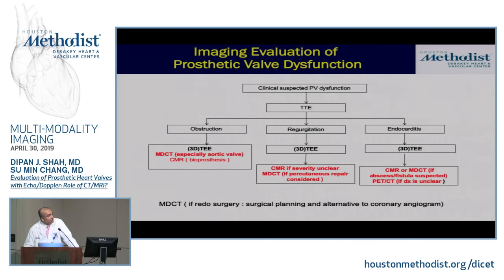And then obviously for endocarditis, really there's not a role for CMR or even CT in diagnosing endocarditis. That's really where you want to move on to echo, potentially with transesophageal 3D echo. And then this is an area where I think hopefully more data will emerge for the potential role of PET to help in identification of endocarditis and complications as well. But I think where the advanced imaging modalities clearly can be helpful is not so much in diagnosing endocarditis, but looking for the complications of endocarditis.